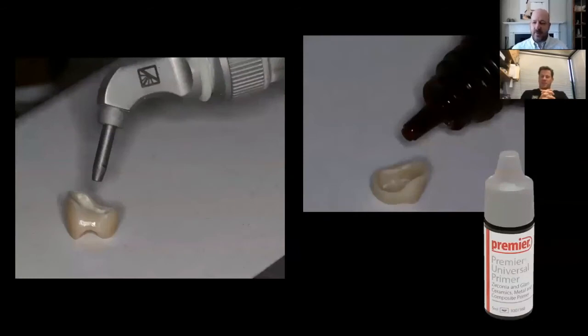So we got the temp off, we've cleaned the preparation, and we've done a wonderful job because we don't have any hemorrhaging. Now we're looking at the final crown here. The way you talked about preparing the stump for ideal bonding — I feel like you're just as meticulous with preparing the inside of the crown as well. So what did you do here? You did some air abrasion and a priming?